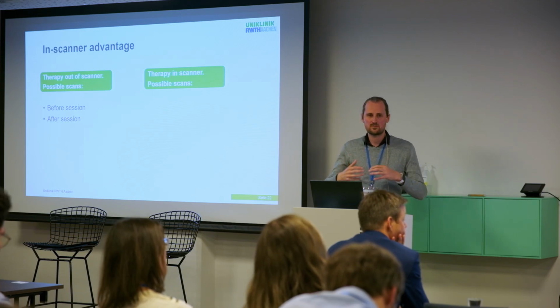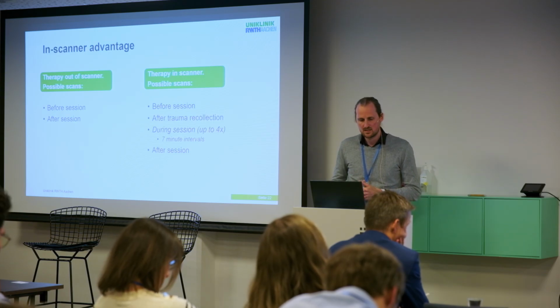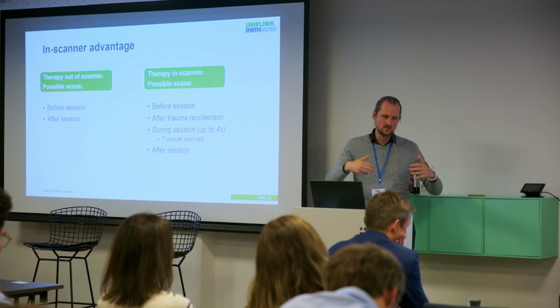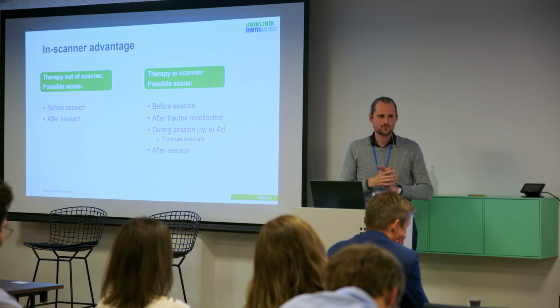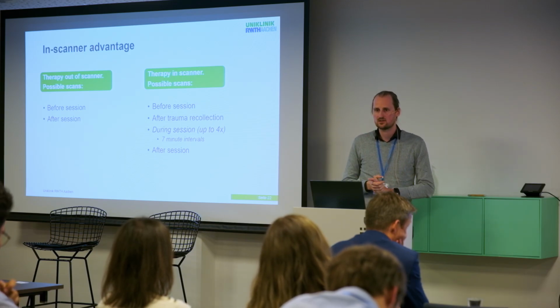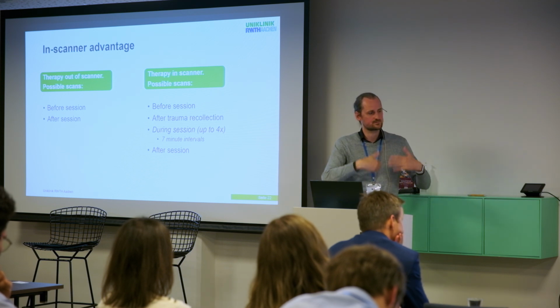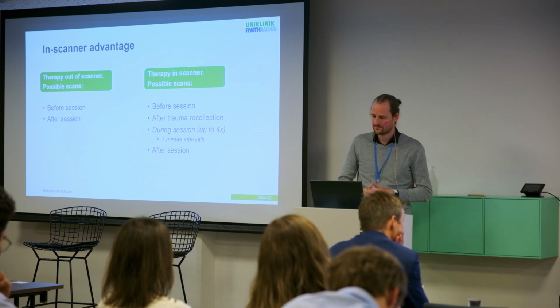However, by conducting the therapy inside the scanner, we gain a few extra options. So, of course, we can measure the participant directly before they undergo the session, with the added benefit of having less time between. Because, of course, if you do a therapy session outside the scanner and then prepare the participant for a measurement, time goes over that again.